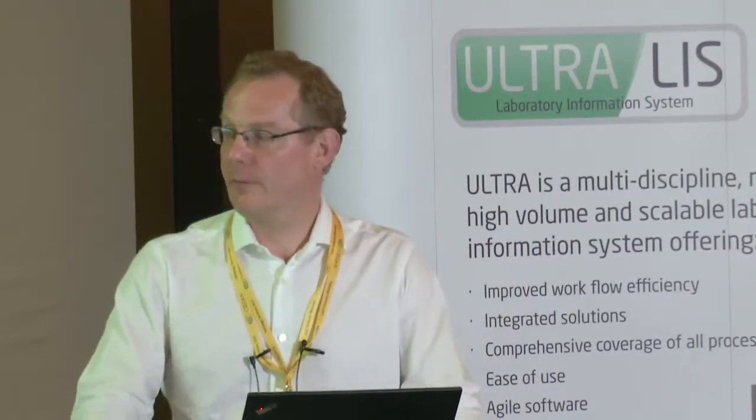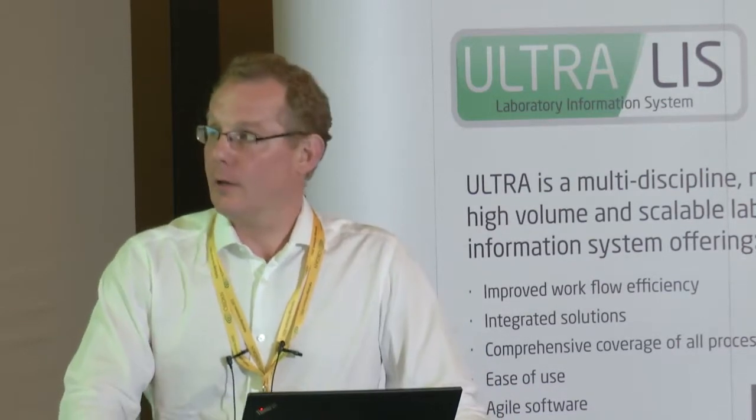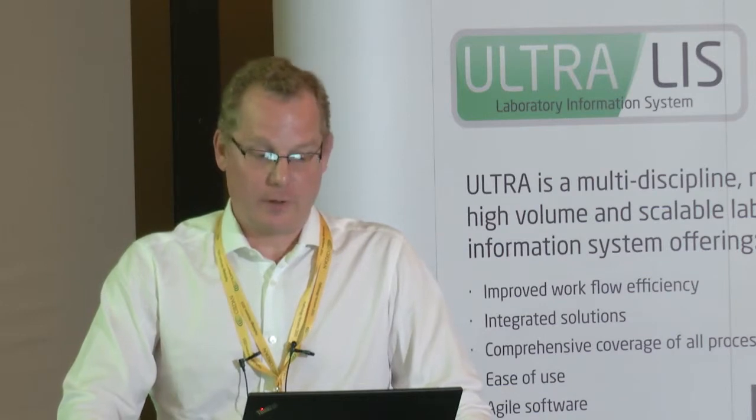People have to adapt to a slightly new way of working, which always causes some degree of problem to start with. There are indeed some things that you still, and will continue to, need glass to do properly. So examining polarization, under polarized light rather, can still only be done with a microscope. This system hasn't really been validated for cytology, although it does work quite well. We didn't include cytology formally in the study, and it was unable to scan oversized slides, so the large blocks still have to be looked at on glass.